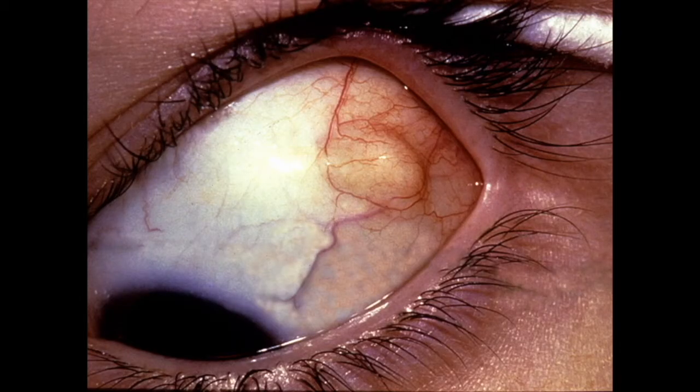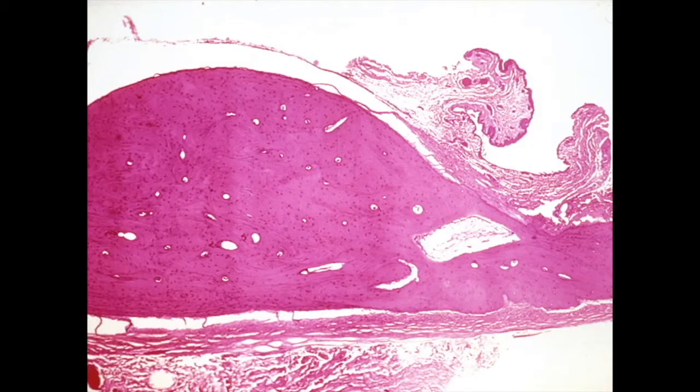This is the clinical photo of an epibulbar osseous choristoma. I've seen several of these in my career. These are actually little nodules of mature bone beneath the conjunctival epithelium on the surface of the eye, typically in the supratemporal quadrant. Here's the histology of that case showing the bone beneath the conjunctival epithelium. So it's an epibulbar osseous choristoma.